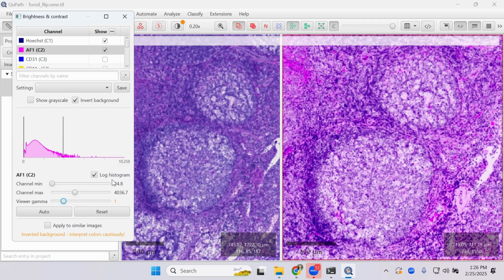Okay, how many of us have Pseudo-H&E settings? That is looking pretty good. We're going to move forward.